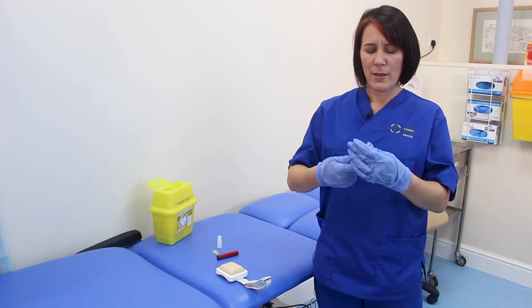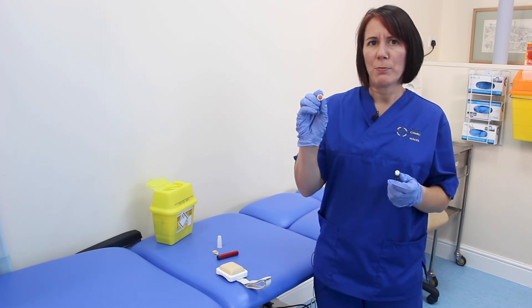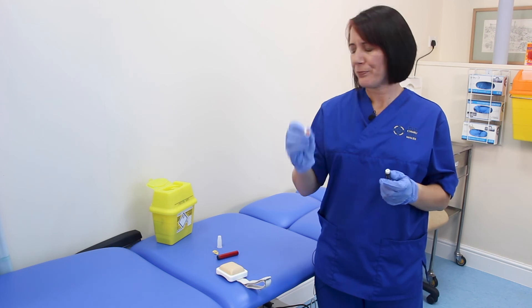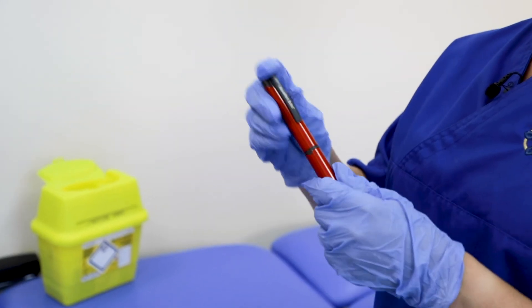When you take the needle away, the needle cap will cover the needle. Twist the safety needle off and you'll get an orange block at the bottom which covers the other end of the needle. Then pop your needle in your sharps box and pop the cap back on your pen.